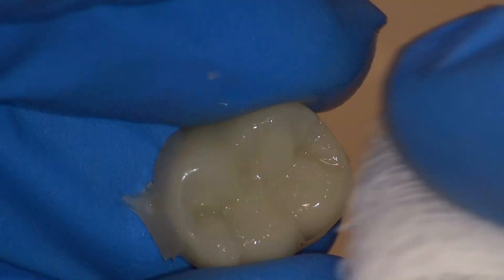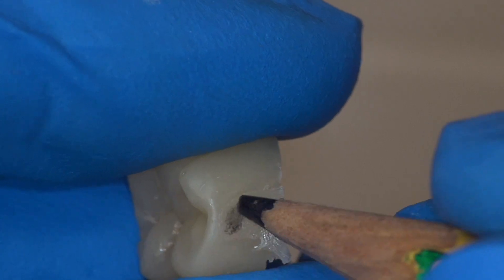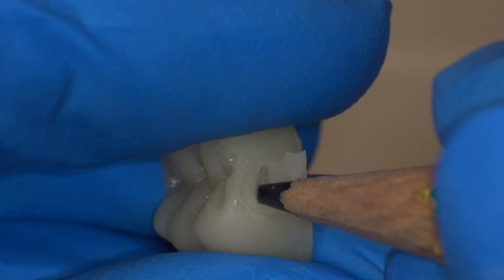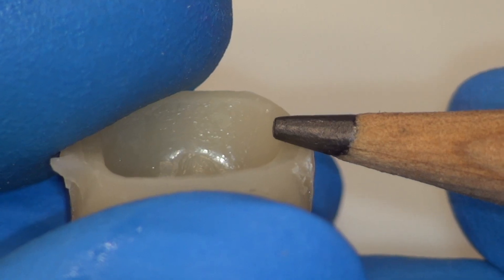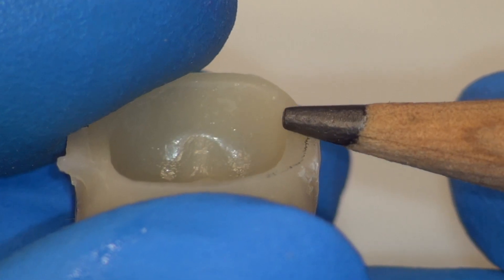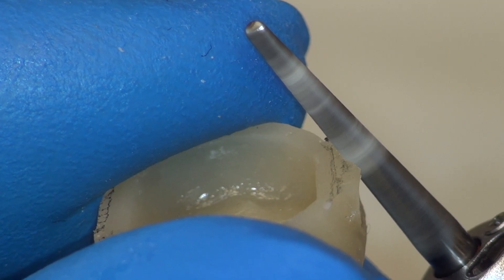We can clean the temporary of the oxygen-inhibited layer using alcohol gauze. With that slippery layer removed, we can mark our contact areas with a pencil. This is very important to make sure we do not create an open contact. We can also use the edge of the pencil to carefully mark our finish line — notice we use the side of the pencil, not the tip.